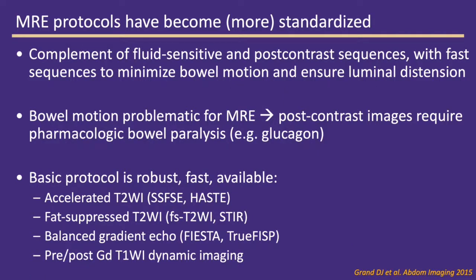MR enterography protocols have been a moving target over time, but I think we're to a point now where they're reasonably standardized, both at our institution and externally. They combine a complement of fluid-sensitive and post-contrast sequences, including some that are acquired very rapidly so that you minimize any bowel motion and you ensure that the luminal distension you've worked hard to achieve with your oral contrast agent persists through the scan.